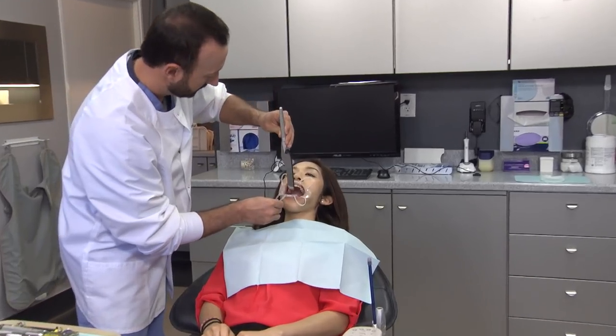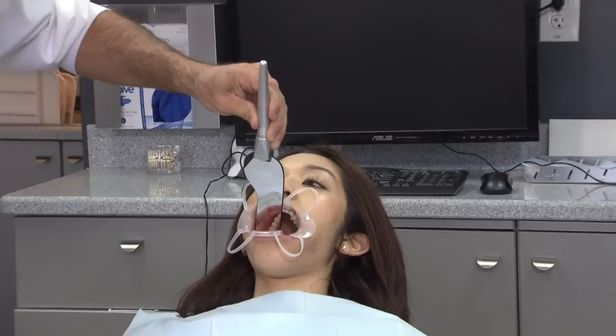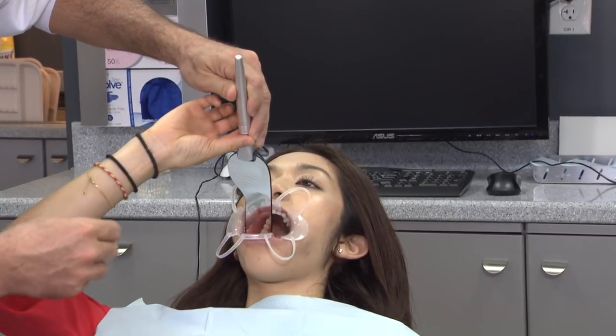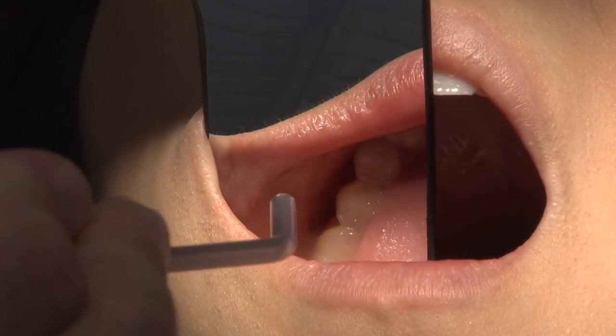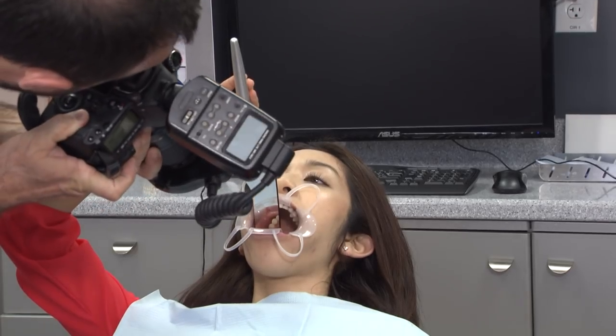If you are the only practitioner available, the use of an intraoral mirror with a handle is convenient to allow the patient to hold while you simultaneously defog the mirror and acquire the photo.